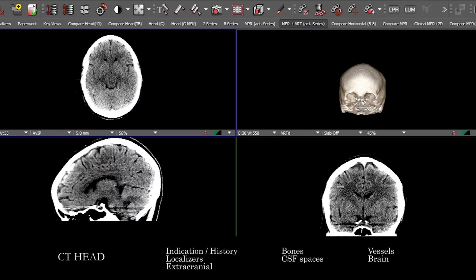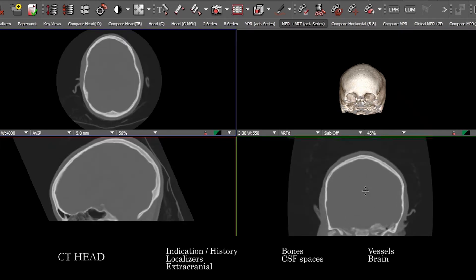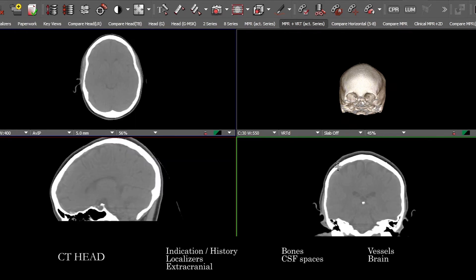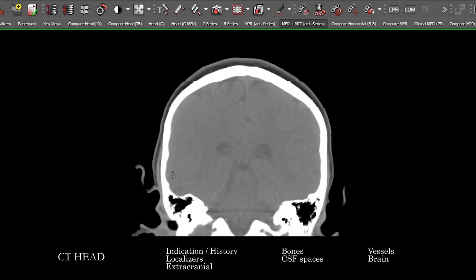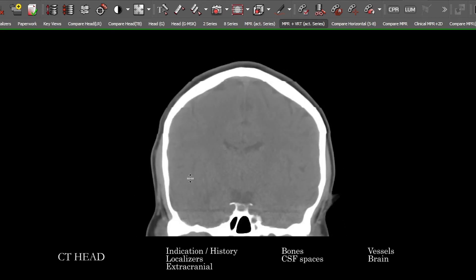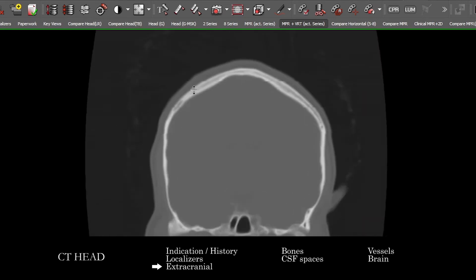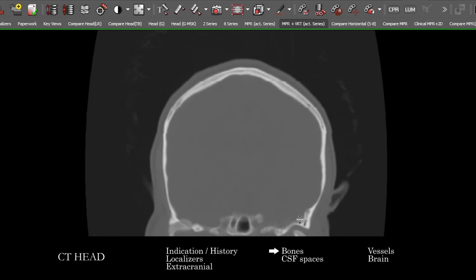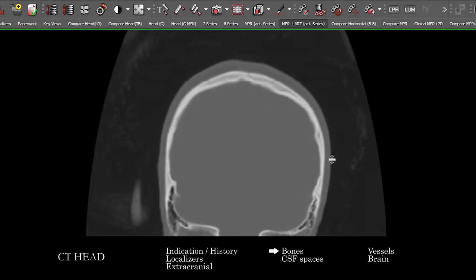We can use the coronal and sagittal reconstructions for different things. If you found anything on the axials as you were searching through, you can use the different projections to problem solve. Frequently I like to do the different compartments together on the different projections. You can look at the extracranial soft tissues and then the bones — different areas are going to be better demonstrated on the coronal or sagittal reconstructions.